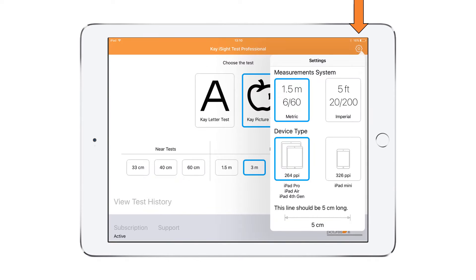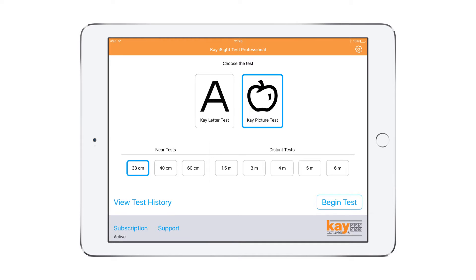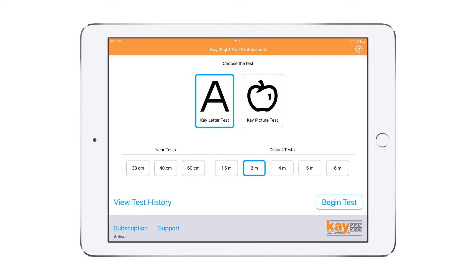From the home screen, you can change the settings, change the testing distance, and choose between picture or letter optotypes.